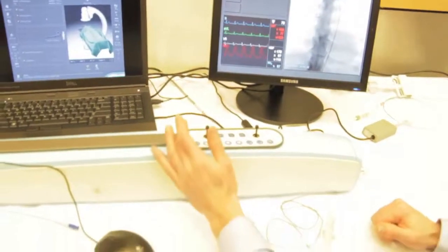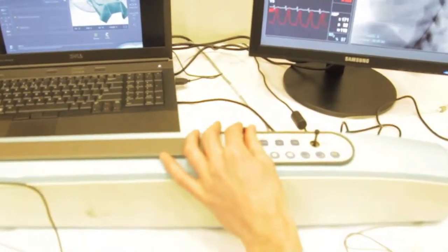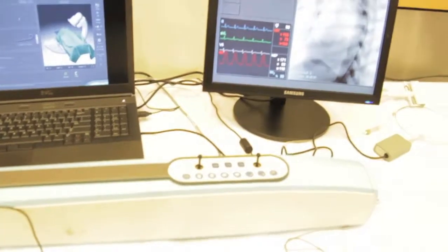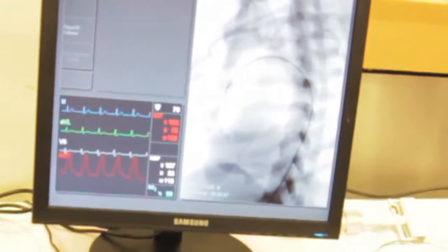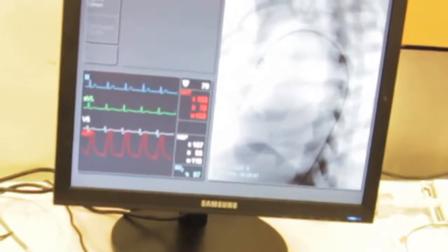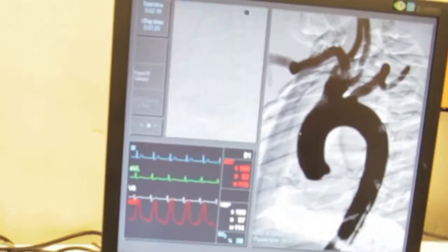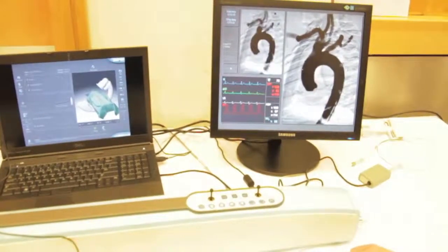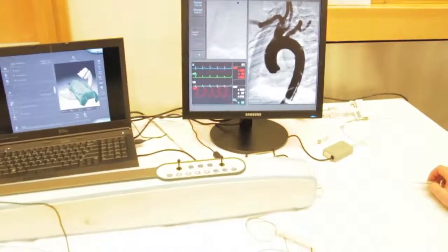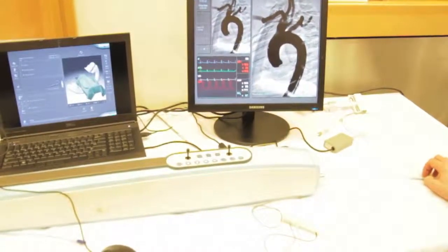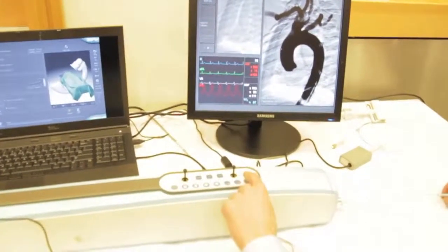We need to adjust the angle of the C-arm to open up the aortic arch, at which point we'll do a subtracted angiogram. We're going to inject 30 mils of contrast at 15 mils a second — the exact volume is not critical. On this image we can see a subtracted angiogram showing all three arch vessels: the innominate, the left common carotid, and the left subclavian artery. Some vessels are overlying each other, which is a demonstration of patient movement during the angiogram, but the image is probably good enough to carry on.